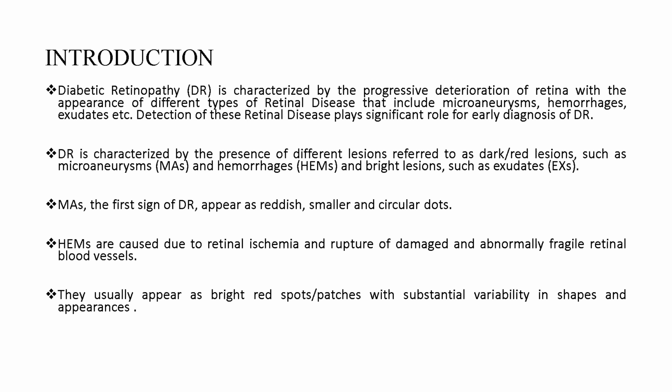And we can see the microaneurysms, the first sign of diabetic retinopathy, appear as reddish, small and circular dots. They usually appear as bright red spots and patches with substantial variability in shape and appearance. And this is the introduction.